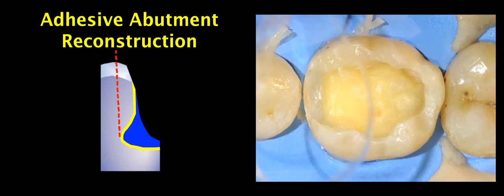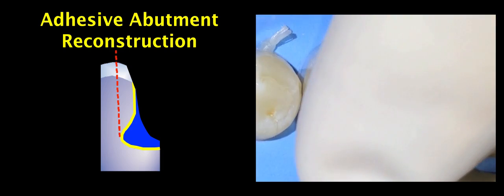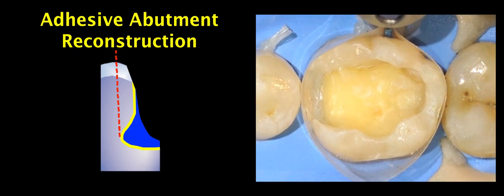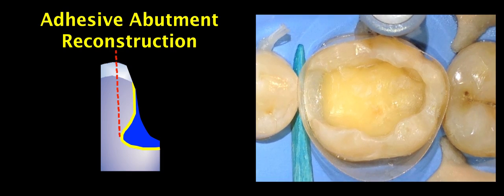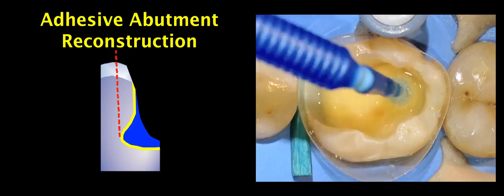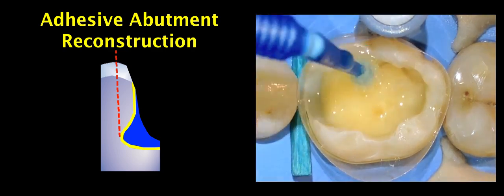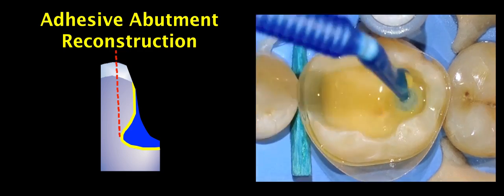Looking at this demonstration video of adhesive abutment reconstruction we may place a transparent matrix. This is good for video because it's easier to observe what's going on. Most of the times I like placing metal matrices. As we have to emphasize adhering to dentin, a two-step self-etching system will be used. The wedge is being placed to stabilize our matrix and then the primer of our two-step bonding system is applied. In this case we used Optibond XTR from Kerr and the microbrush is used to scrub the primer to the dentin because this obtains better results. We must give time for the primer to condition the dentin so we leave it some time and then we apply a second portion. I prefer using about 30 seconds.